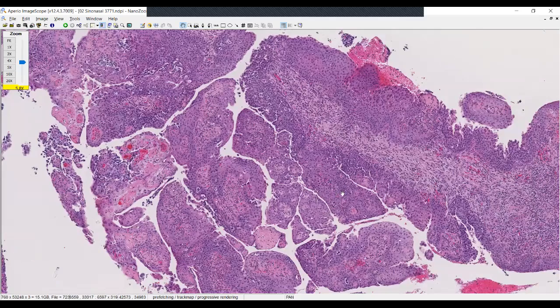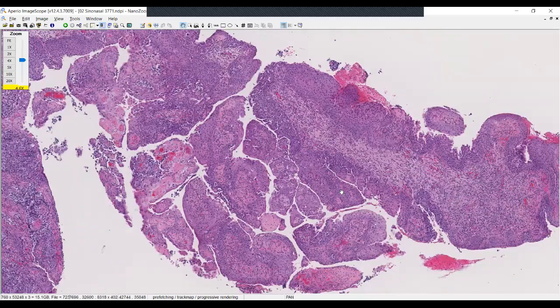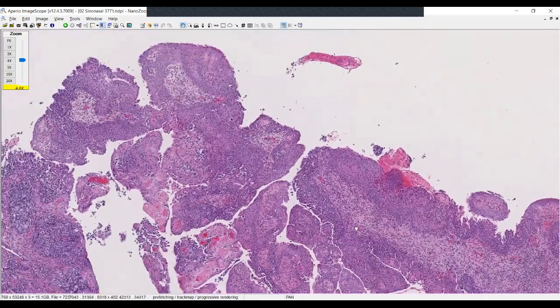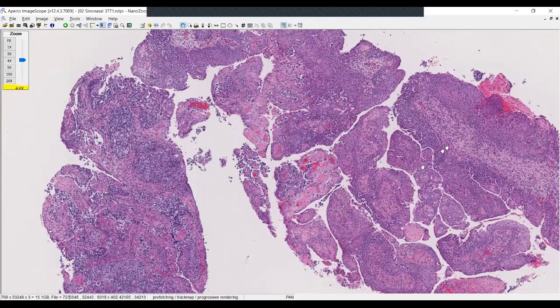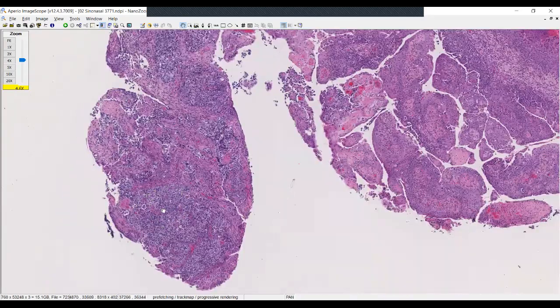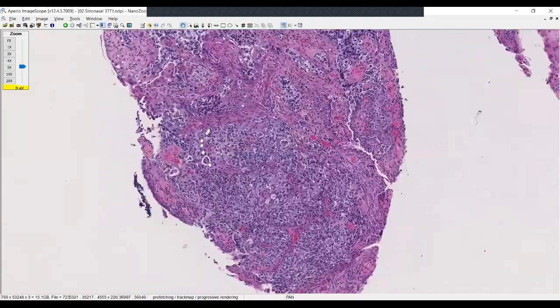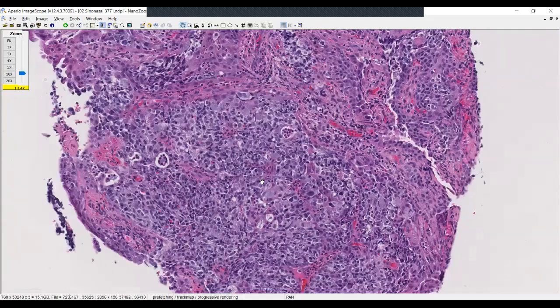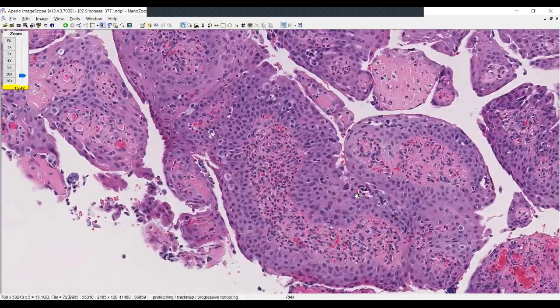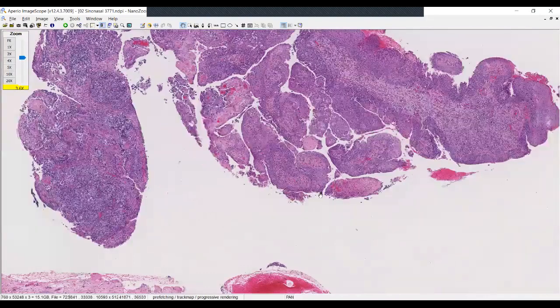As you know, they used to be called Schneiderian papillomas, but that particular name has changed, and now they are just called sinonasal papilloma with either inverted, exophytic, or oncocytic used as a descriptor. So when I look at this, I think that there are really areas of a sinonasal papilloma immediately identified here. And then in this space immediately adjacent to it, you can tell that there seems to be a transition where there now is slightly more pleomorphism present in this cell population as a comparison to what we were just looking at over here with a very unremarkable squamous or transitional epithelium.